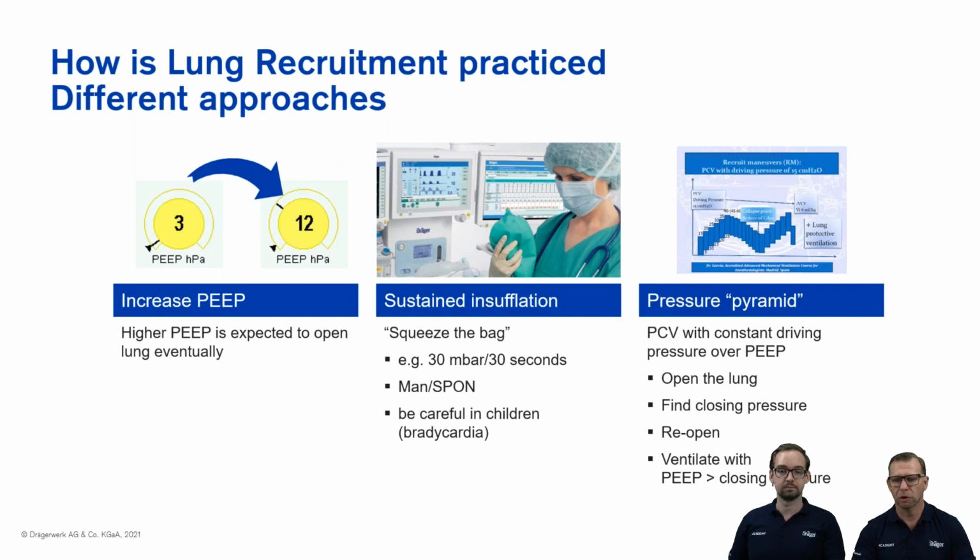So there's just the very basic approach of increasing PEEP. You see you've got some challenges with that particular patient. You've maybe got a little bit of a reduction in dynamic compliance, and gas exchange may not be where it's ideal for that patient, and you can just increase PEEP. Most anaesthesia devices will do this effectively and do this well.